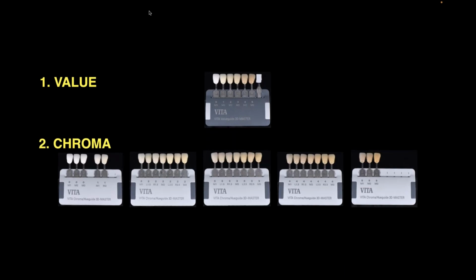An example for that: you see an A1 with very translucent surface. Well, if I actually built the case with A1 dentin and very translucent surface, what would happen? I wouldn't have A1 at the end. I'd have a lower value, or maybe a C shade. Why? Because I have too much light passing through the enamel and hitting my A1 dentin. So my point is, the value that I'm picking is really based on that translucent level, and that allows me to say, okay, maybe I need to go to a bleach shade or something a little whiter or brighter to give me more light reflection. This way, when I cover it with translucency, I'll have the value that I'm looking for.